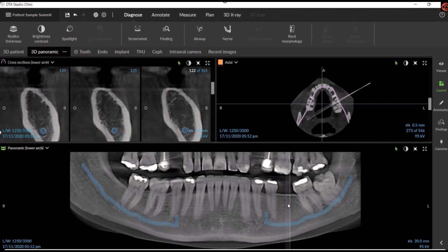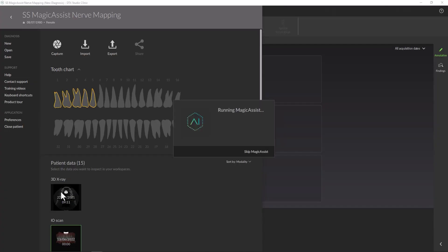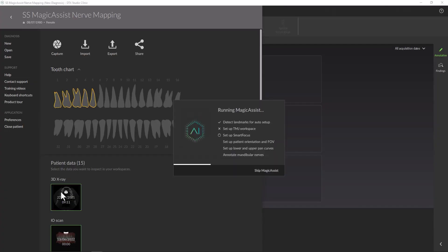Magic Assist will now detect landmarks, set up TMJ if the condyles are present, set up smart focus, set up patient orientation, extract our pan, and annotate the mandibular nerves.